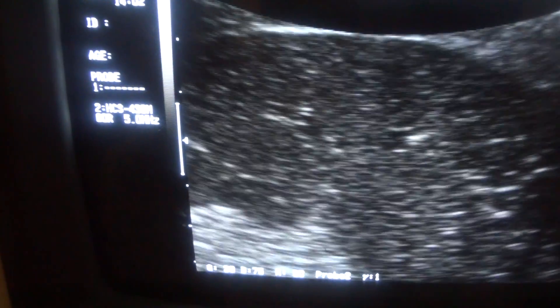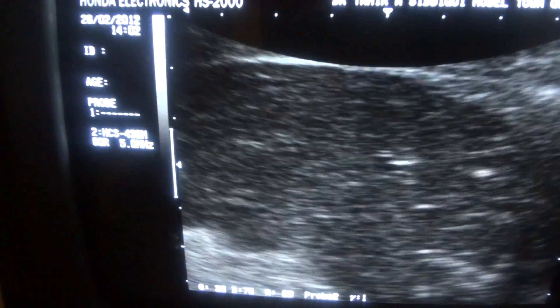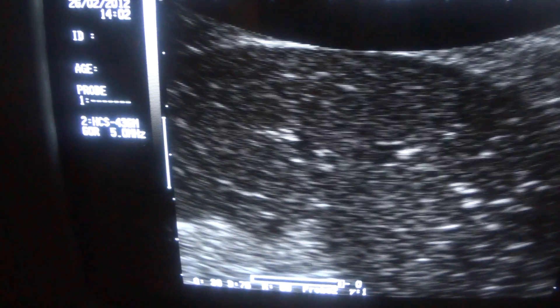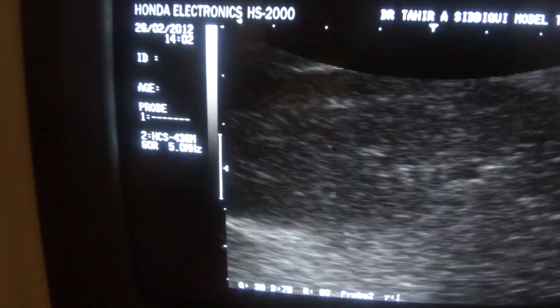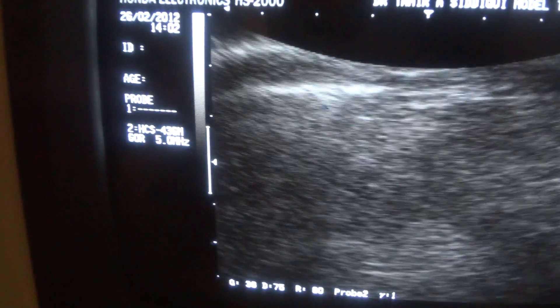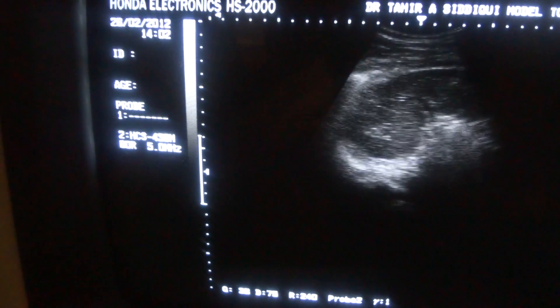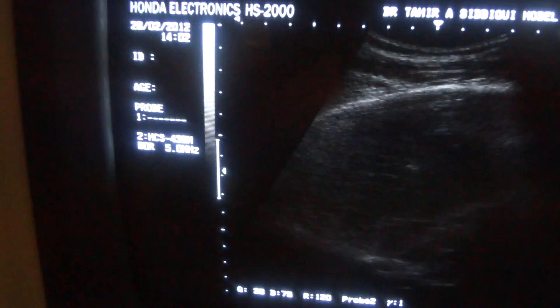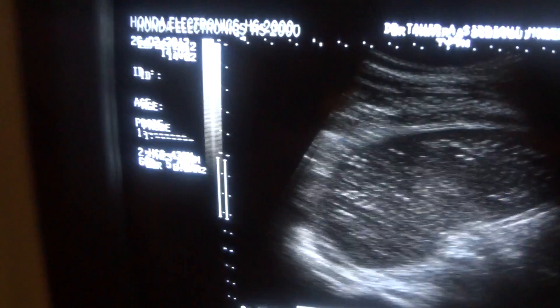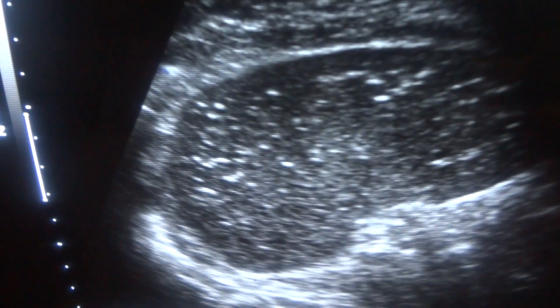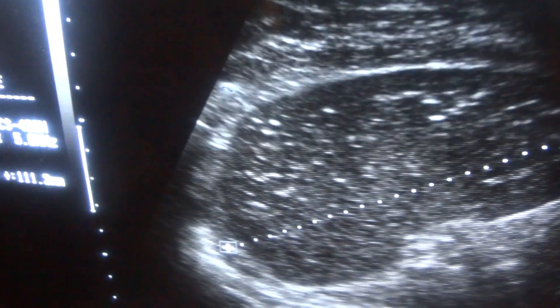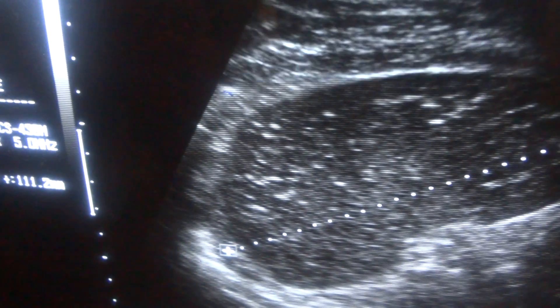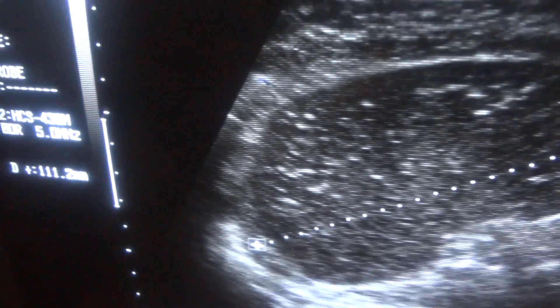How much they are prominent, how much they are in number, depends on the degree of congestion of the spleen, the degree of fluid in the spleen because of infective material and exudate. There is no evidence of pleural effusion. However, classic starry appearance of the spleen, which is normal in dimension. The spleen is 11.1 cm. The spleen should not exceed more than 12 cm.